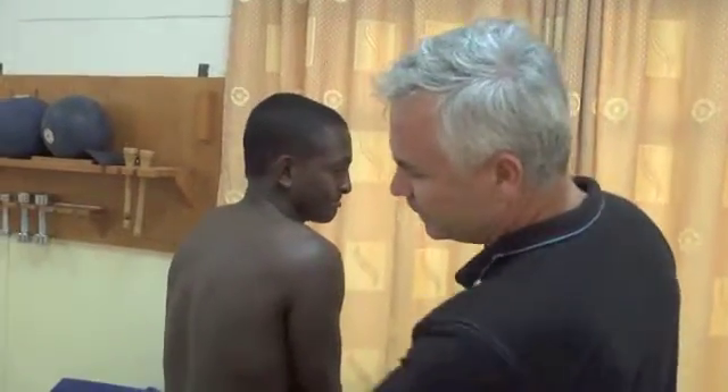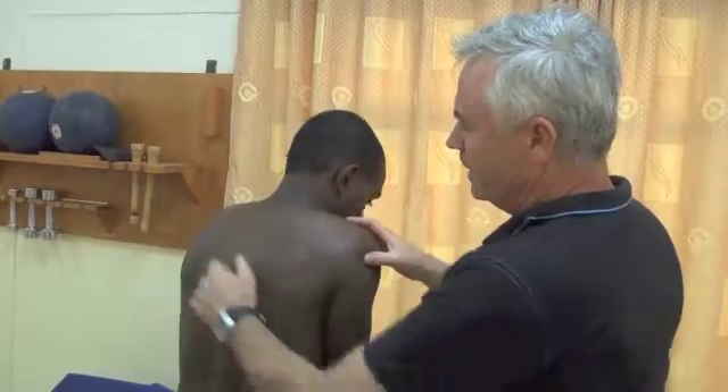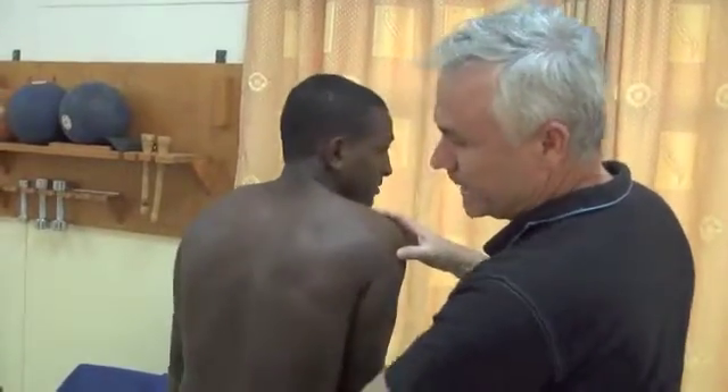So also this case here — a young man, active muscular man — after eight months ago, just by carrying too much weight, has strained his back. From the x-ray there is no skeletal problem, there is no lumbar disc problem. It is just muscle pain. So consequently he works less. So we're just going to apply a simple lumbar application.